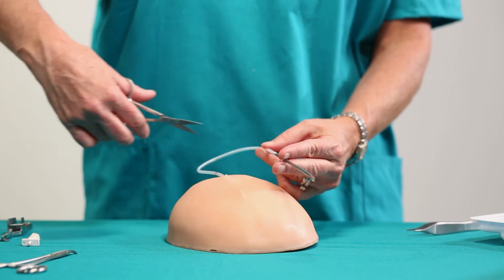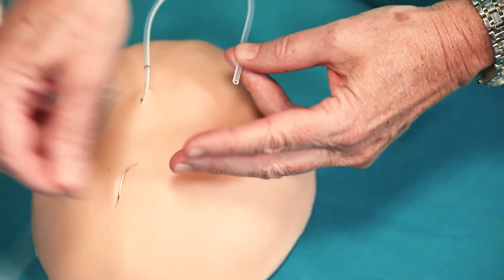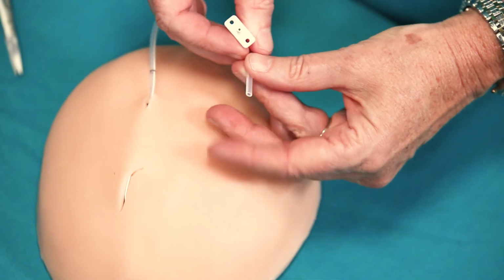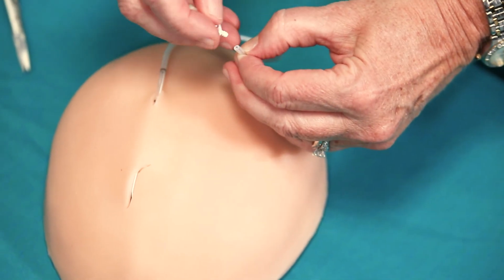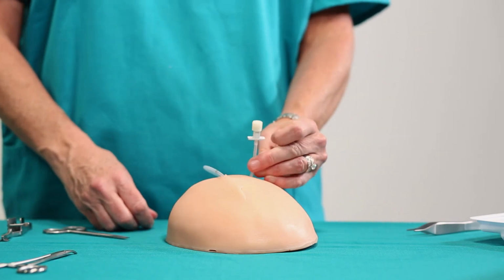Cut the catheter off the end of the trocar. Attach the luer connector to the catheter. Place a closed cap on the end of the catheter to prevent CSF from leaking.